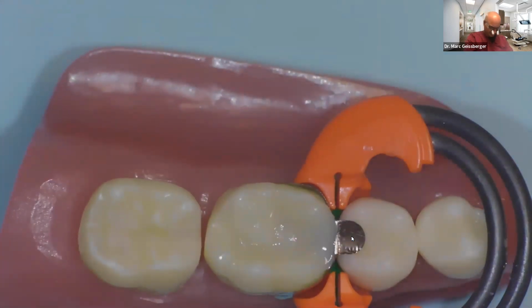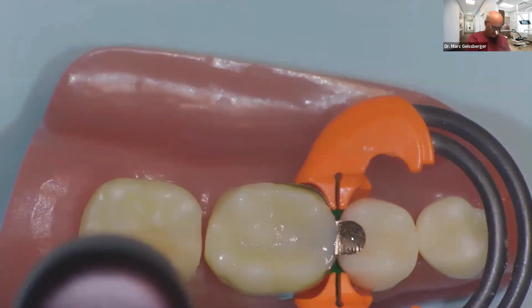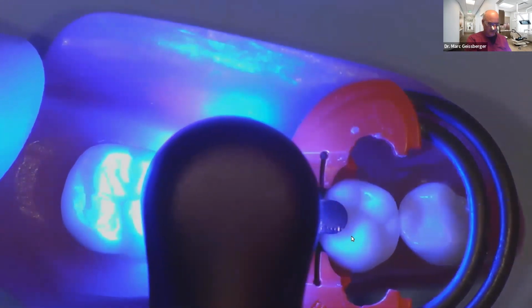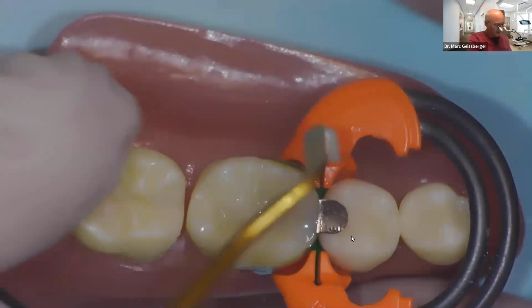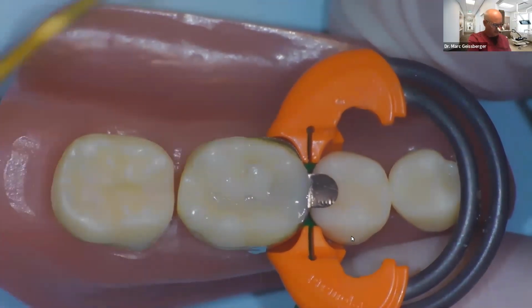Okay, now, again, my assistant's curing. In this case, she can turn the curing, and I'm going to do that to 5 seconds. Why? Because now I'm placing these individually. So I'm going to go on to the next one. I have then 5 seconds to cut my next amount of composite while she's curing. I would have already been done and standing by. I would have immediately re-entered the mouth with my next layer.